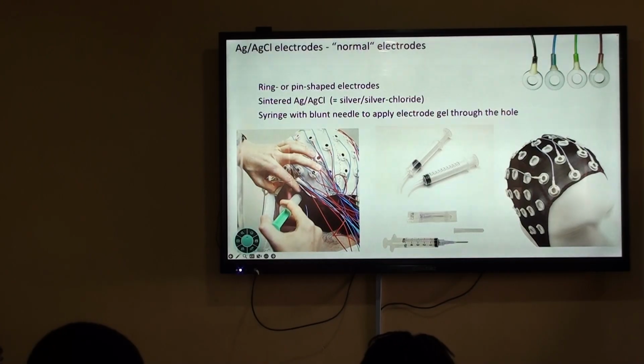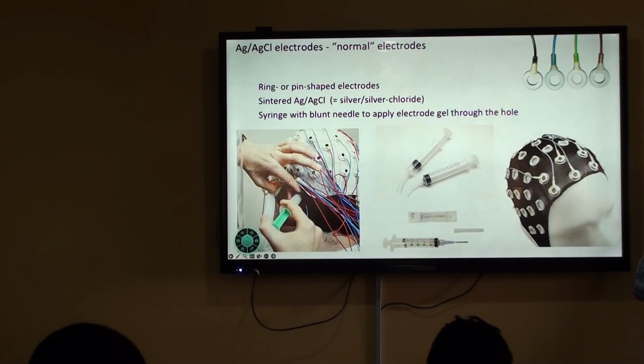That's interesting to hear. Of course, with bridge electrodes, it is more difficult to place a lot of them. So how many bridge electrodes are you using? 16 channels. Yes, so that means that spatially you're not getting so much information. But that, of course, depends on the research question, whether you need so many channels or whether you can work with fewer channels. For the most part, it's for shorter tests, not for long ones. It's interesting. There was one more question there in the back.